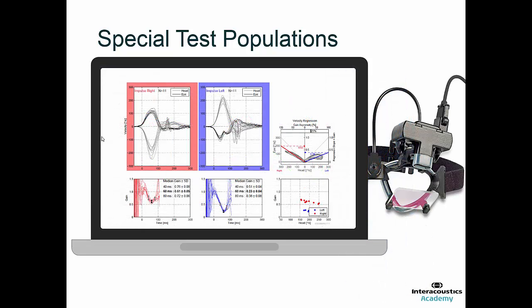And again, what we can see here is that in fact this patient does have a bilateral vestibular loss. And therefore we weren't able to detect the asymmetry on the rotary chair test because both vestibular systems were affected, but we can measure the asymmetry properly with the video head impulse test, and we can see that both sides have reduced VOR gain because it's a side-specific test.